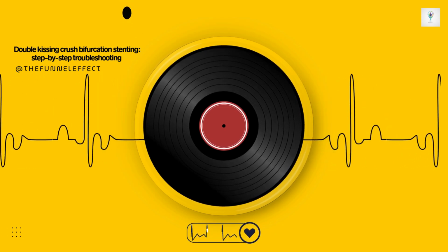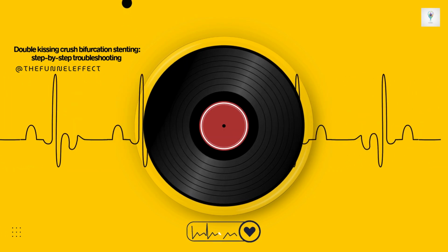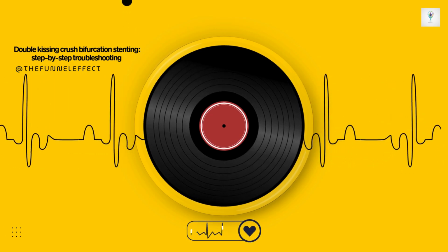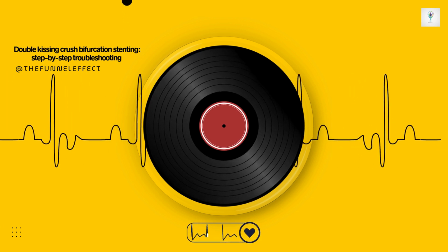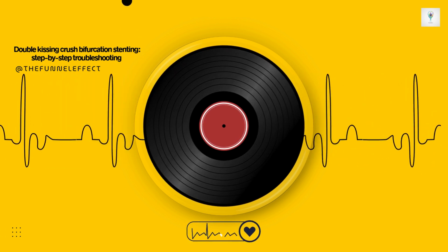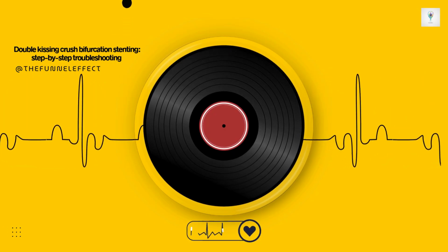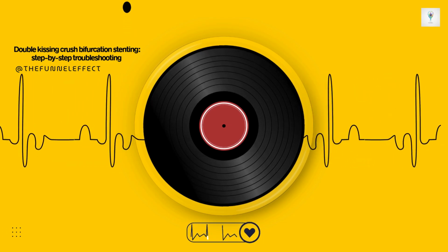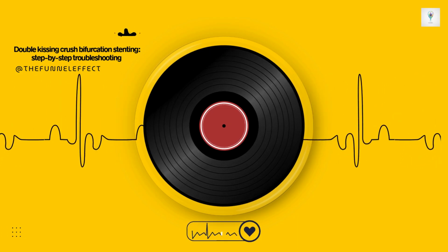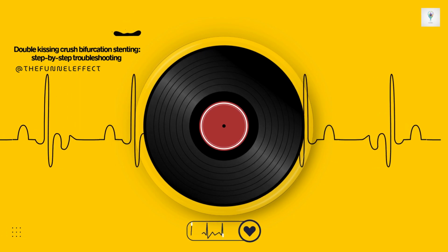Okay, SB stent deployed. Crushing balloon ready. Step 4, balloon crushing of the SB stent. Inflate the balloon in the MV, crush the SB stent struts. But wait, check first. Yes, absolutely. Before you crush, take a good angiogram, maybe even use IVUS or OCT again if you're unsure. You must confirm the SB stent is fully expanded and looks good. Check for any dissections or problems at the edges of the SB stent. Once you crush it, accessing the SB again becomes much, much harder. You don't want to trap a poorly deployed or problematic stent under another layer of metal.